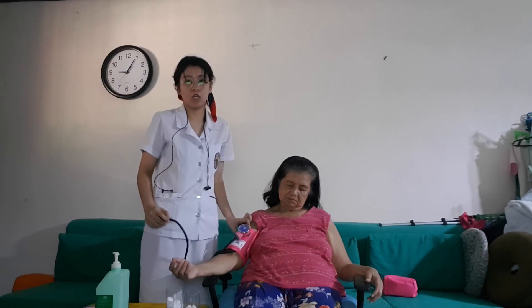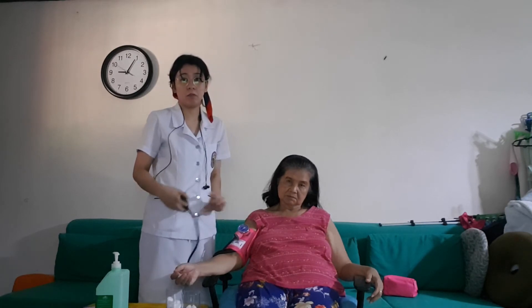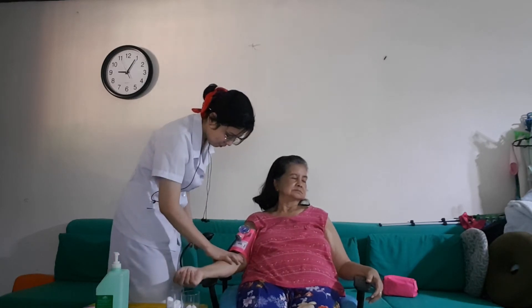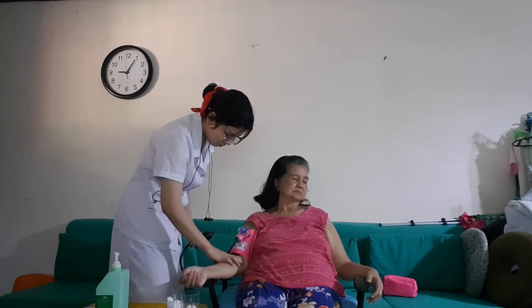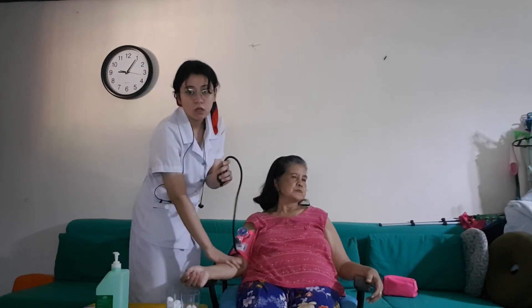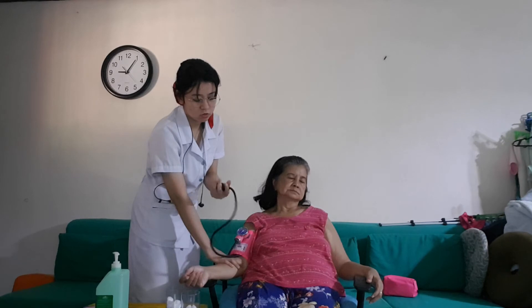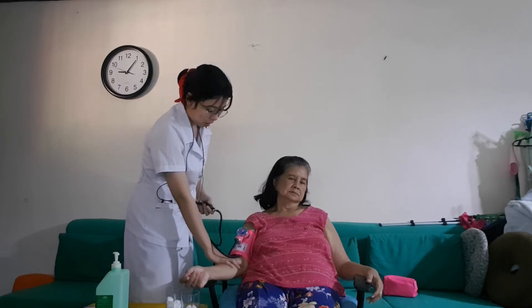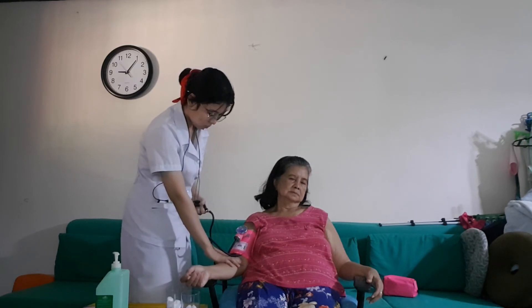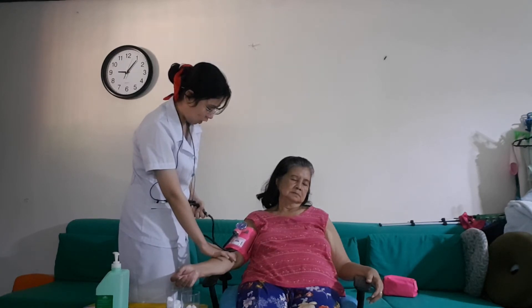If this is the client's initial examination, you have to perform the preliminary palpatory method. We have to palpate the brachial pulse with fingertips, then close the valve by turning it clockwise. We will pump the cuff until we no longer feel the brachial pulse — at that pressure, blood cannot flow through the artery.